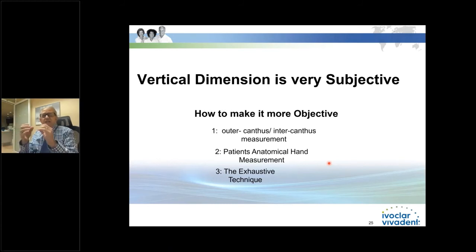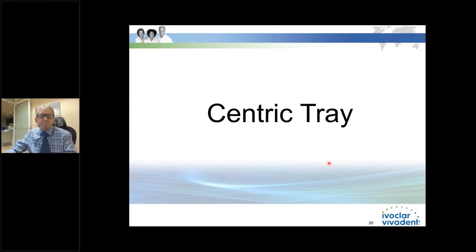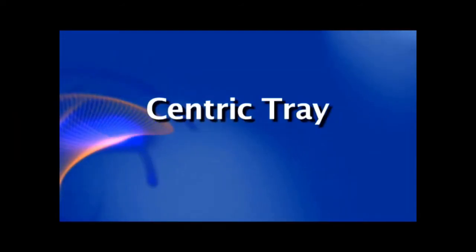And so when we get it, the patient's not going to be wide open, nothing. You're going to be surprised at how much time this definitely saves you. And then again, you're going to start doing the phonics. Now we've got to take the vertical, and we've got to have some way of taking that vertical.